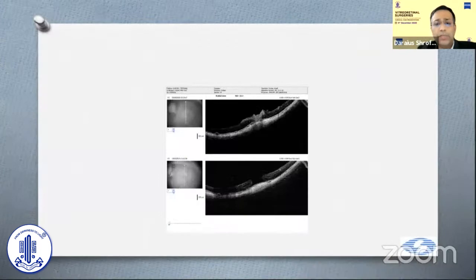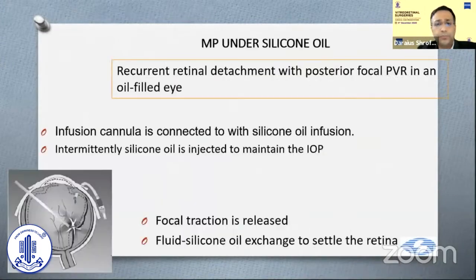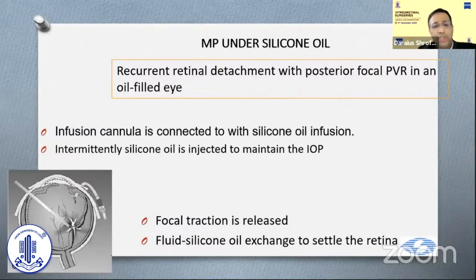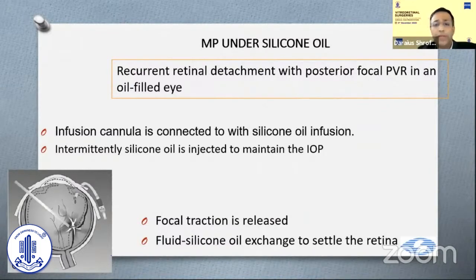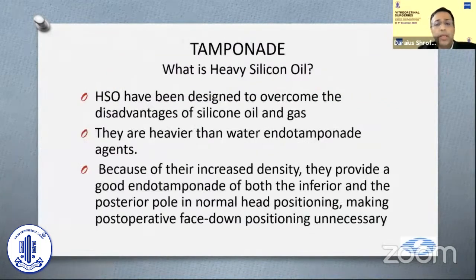This is another pre-op versus post-op picture. Regarding membrane peeling under oil: if you have a recurrent detachment with a focal area of traction, you don't need to remove all the oil. You can just do a localized membrane peeling under oil and then settle the retina quite well with this maneuver.